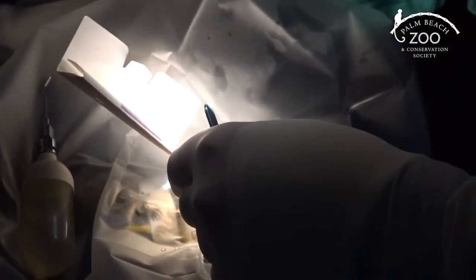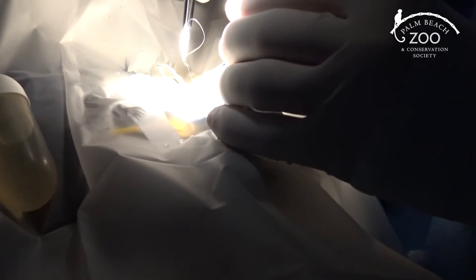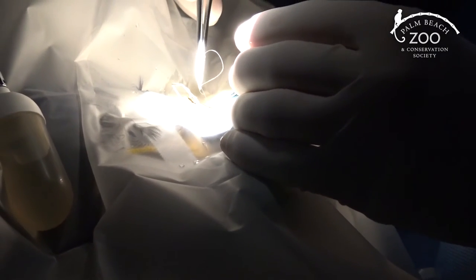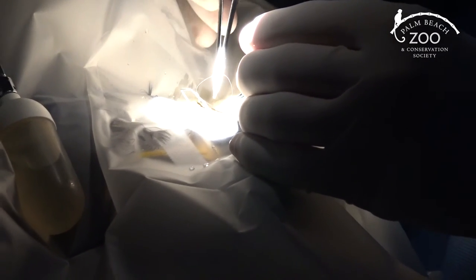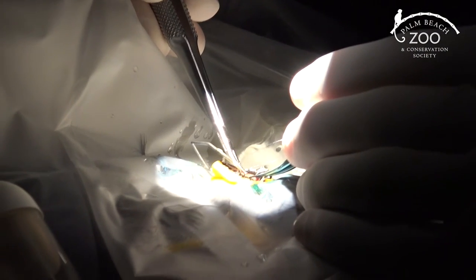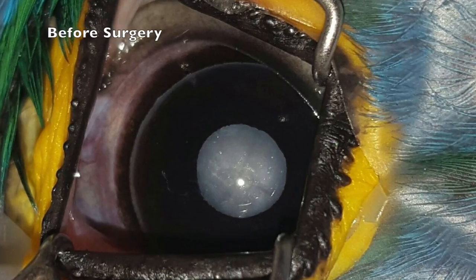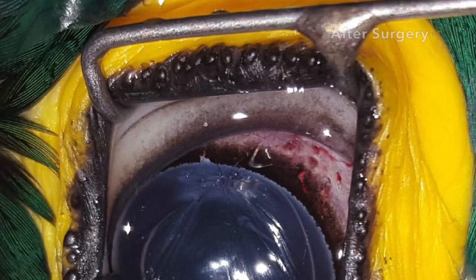Now she is preparing to start suturing — closing and sewing that incision in the cornea. The material she uses is literally the size of a strand of hair. She will close the cornea, which is a lot like sewing on jello. She'll put a couple stitches in, and then Paris will be done with that eye, and we will turn him over to do the exact same thing on his other eye.